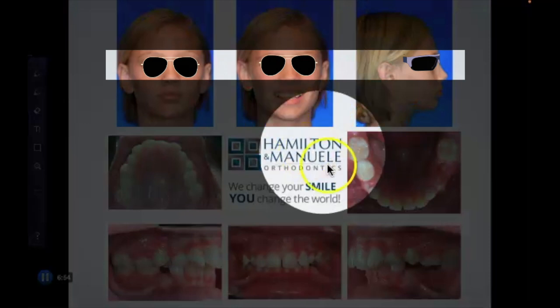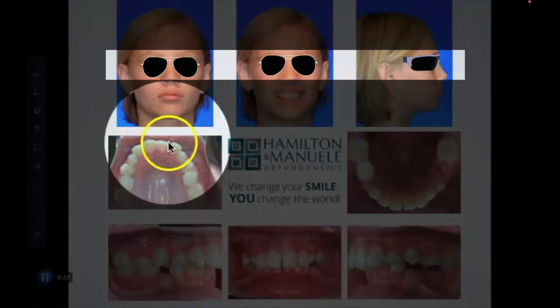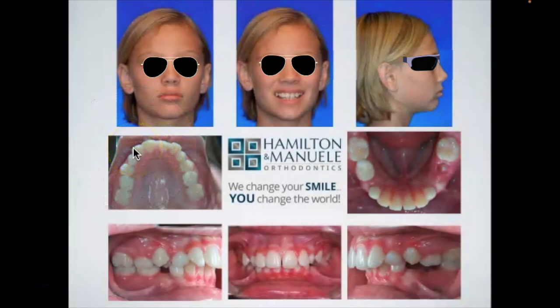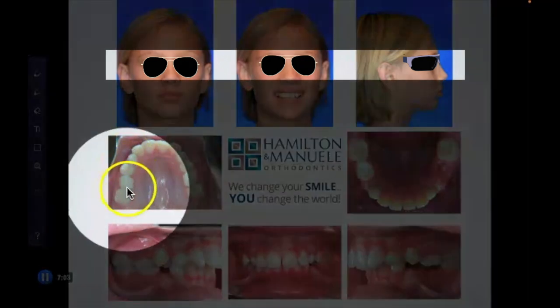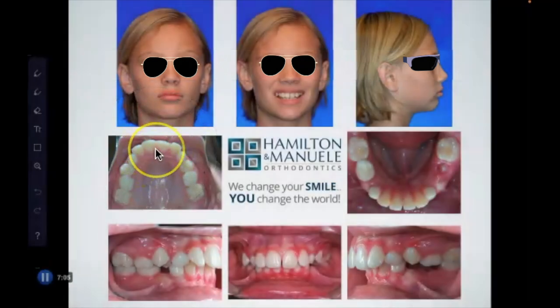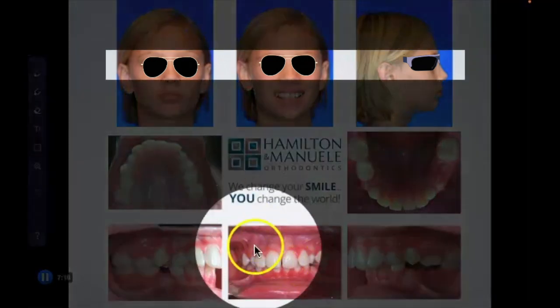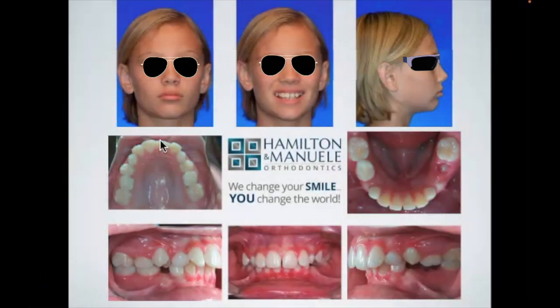Besides this lateral incisor here, you're not seeing an excessive amount of the lingual surface. Looking at the arch form as a whole, they might be a little proclined, and we'll see that on the Ceph soon. You have a little bit of spacing, which might indicate a little proclination, but you're not seeing proclined teeth that are way out there and that you'd get really worried about from a trauma standpoint.